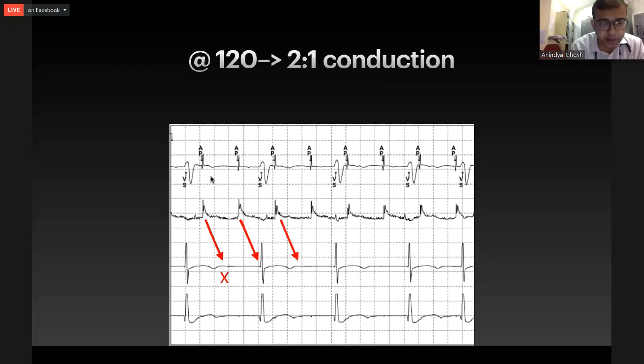Now this looks familiar, in that normally a pacemaker behaves like what the patient's own conduction system is behaving. Normally with a pacemaker, if the patient's intrinsic atrial rate is at say 120, 130, which is usually the maximum tracking rate which we set, there is 1:1 conduction till 120, 130. After that, the pacemaker goes into a Wenckebach window till the TARP rate or the 2:1 rate. And after the TARP rate, which is around 150 to 160, there is 2:1 conduction.